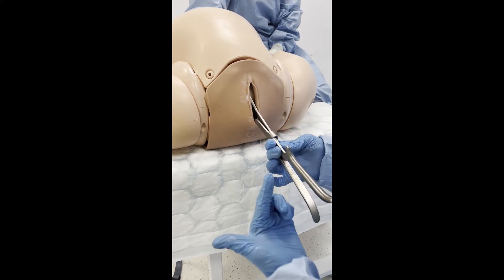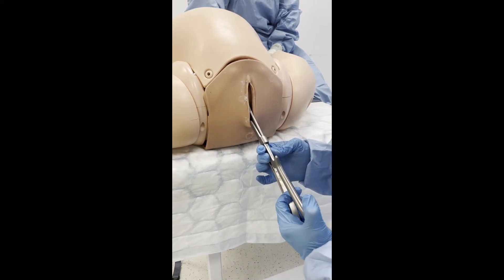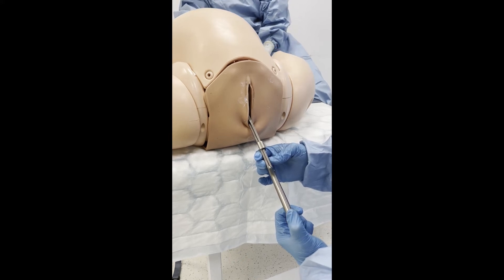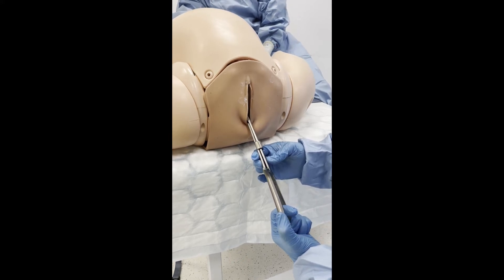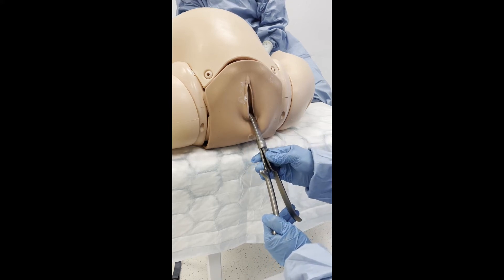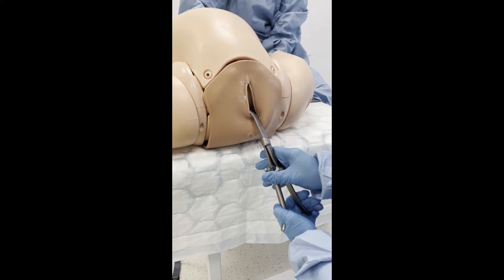In order to create space to rotate the fetus, the head is disimpacted. This is done by bringing the handles of the forceps downwards towards the operating table. Next, the operator pushes gently upwards to displace the head. The fetal head should now be one centimetre higher than its initial station.